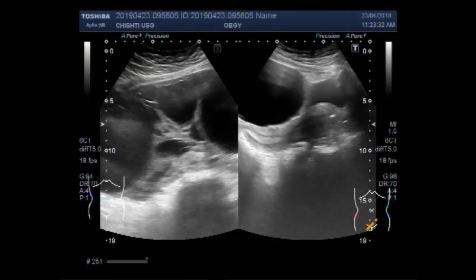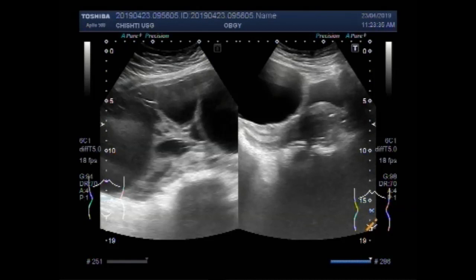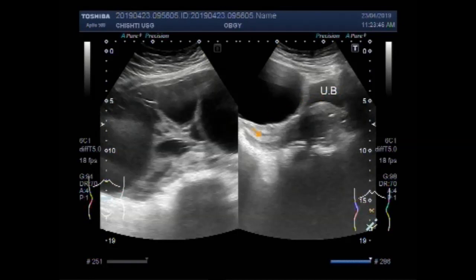Again you can see the relationship to the urinary bladder and the uterus. This is the urinary bladder, this is the uterus, this is the cervix, and this is the large multiseptic cyst.